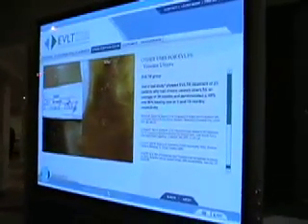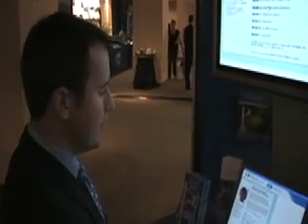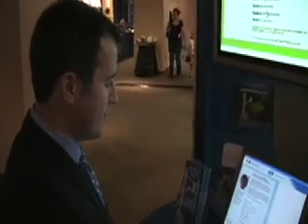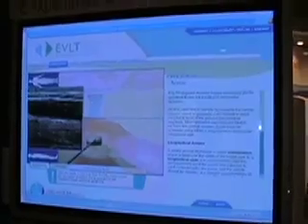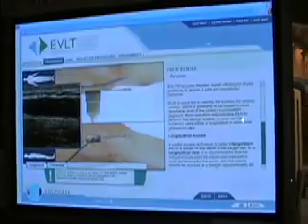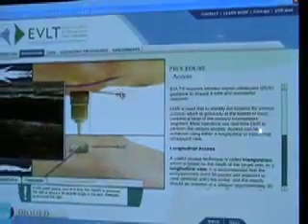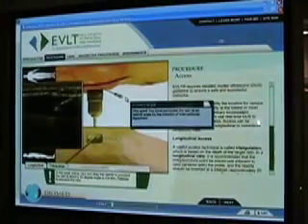We just launched our online training program, which is a highly interactive educational training course for venous disease and endovenous ablation. It has a variety of features, screens, and interactive animations. For instance, here's one for achieving access during an endovenous ablation, where you grab the needle, place it, and achieve the proper angle. Then you see the ultrasound where you're achieving access.